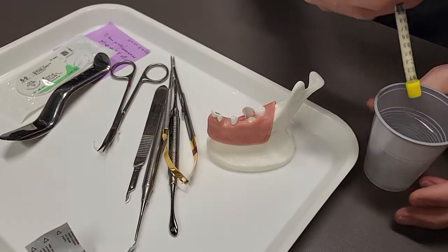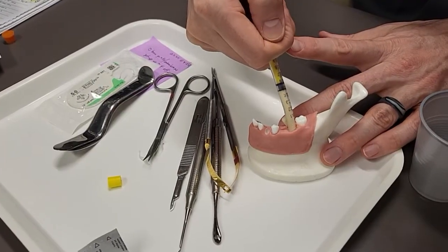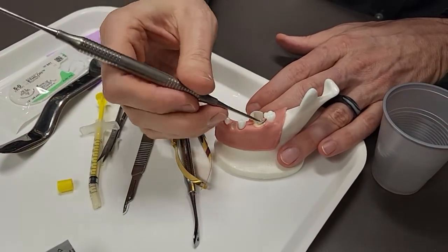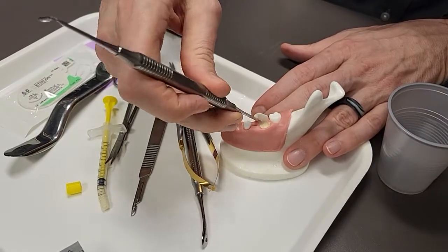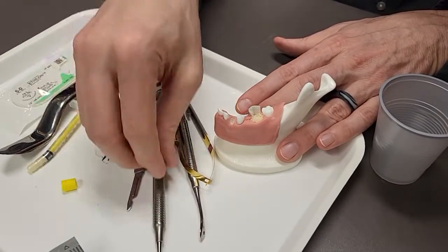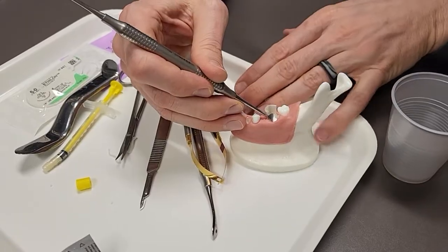This has been hydrating for about ten minutes or so. We squeeze off the rest of the water and take off the little cap. We're just going to kind of plunge in — it'll kind of jump on you, so be very measured. Shimmy, shimmy, shimmy. You want bleeding down on the bottom; it should be infusing with heme. Your height goal — you want to mound it up just a little bit, a little prairie dog mound up there. Pack it down with kind of medium pressure — you want the bone to go all the way down into the base of those sockets, and then add a little bit more so it domes up, just a gentle little dome on top. When the heme fills up, put this right on top and have the assistant with the little white suction touch right on top — it'll just wick out everything over the top so you can see what you're doing again.